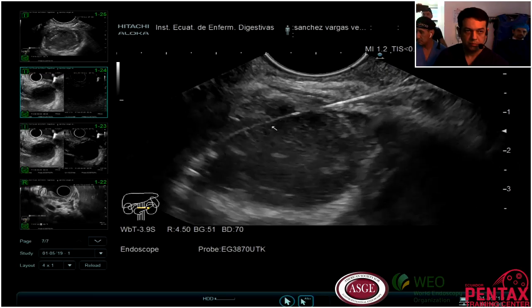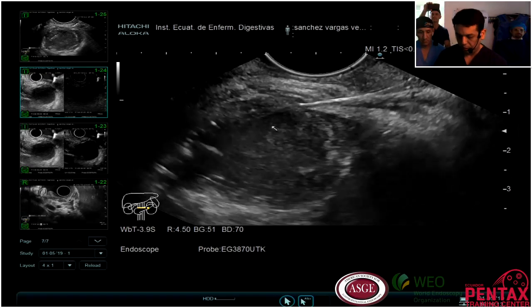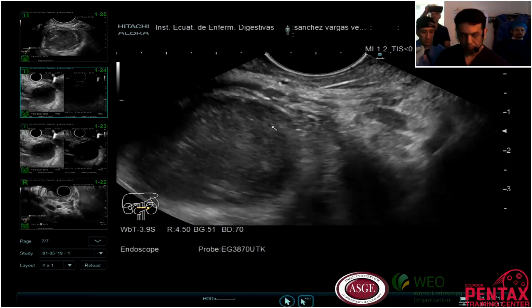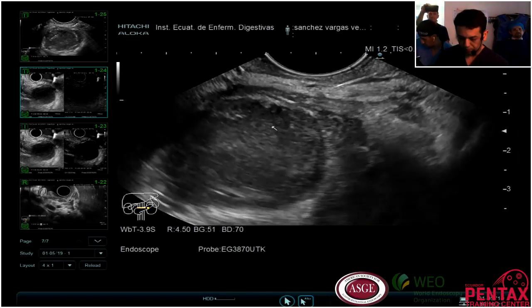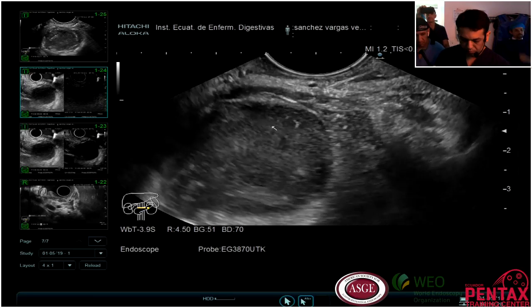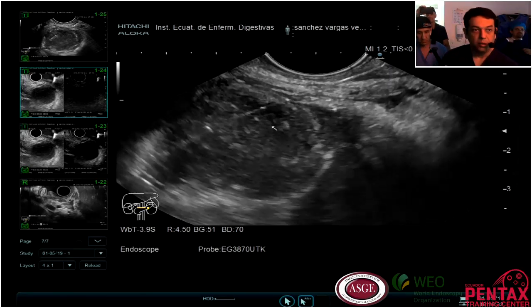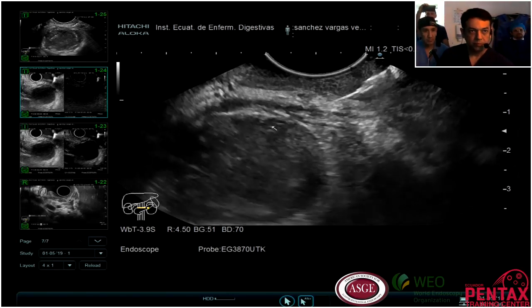I think this will help a lot this patient. So now we are very well positioned. My axis is out.